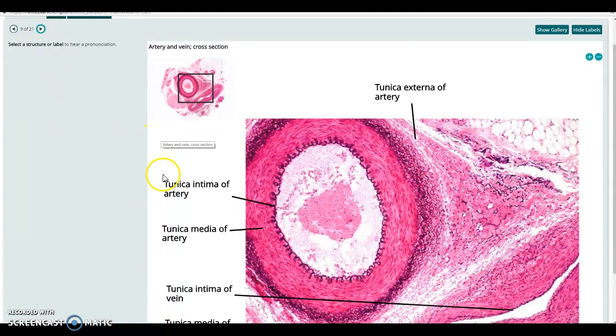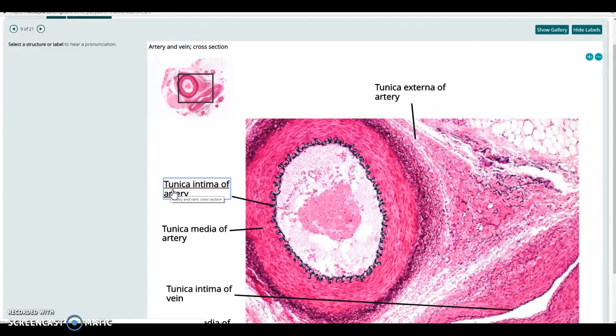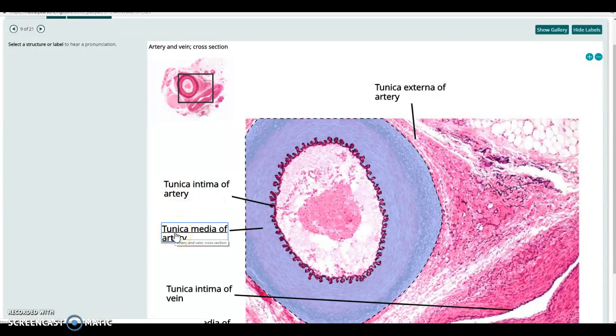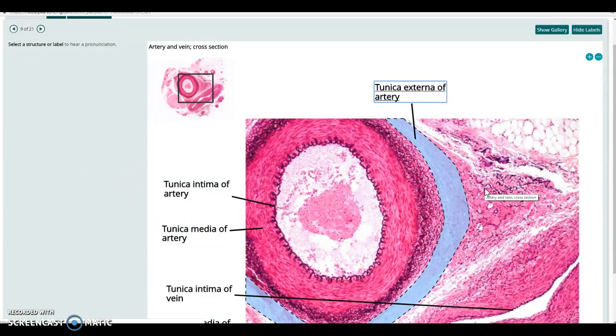This is looking at the inner lining of the artery is what we call the tunica intima or the endothelial lining, the simple squamous lining of an artery. The tunica media includes the smooth muscle wall of the artery and some elastic fibers. And then that tunica externa over here is the connective tissue layer around the outside.